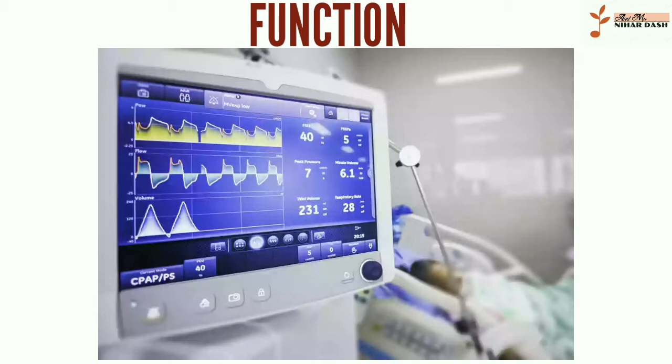In Canada and the United States, respiratory therapists are responsible for tuning these settings, while biomedical technologists are responsible for the maintenance. In the United Kingdom and Europe, the management of the patient's interaction with the ventilator is done by critical care nurses. The patient circuit usually consists of a set of 3 durable, yet lightweight plastic tubes, separated by function, e.g., inhaled air, patient pressure, exhaled air.